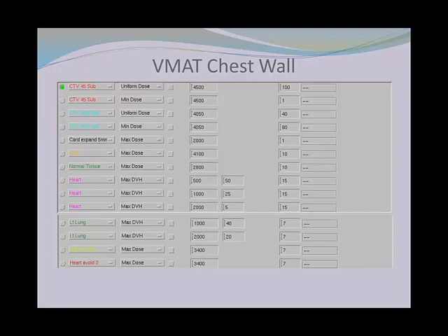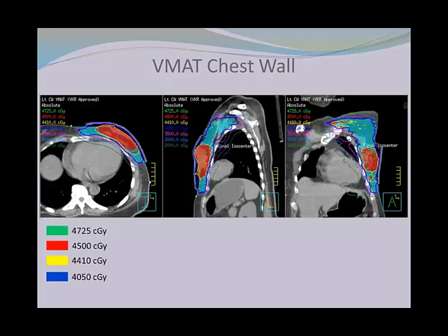So here is the dose volume histogram. For this patient, where I am, we couldn't do breath hold VMAT. But in some other centers, I know that they can do VMAT with breath hold. I'm sure that if this patient could get VMAT with breath hold, we would be able to lower the heart and the lung dose. But overall, it's not so bad at all. We're able to meet the dose and the heart constraint, even though we couldn't do breath hold on this patient.